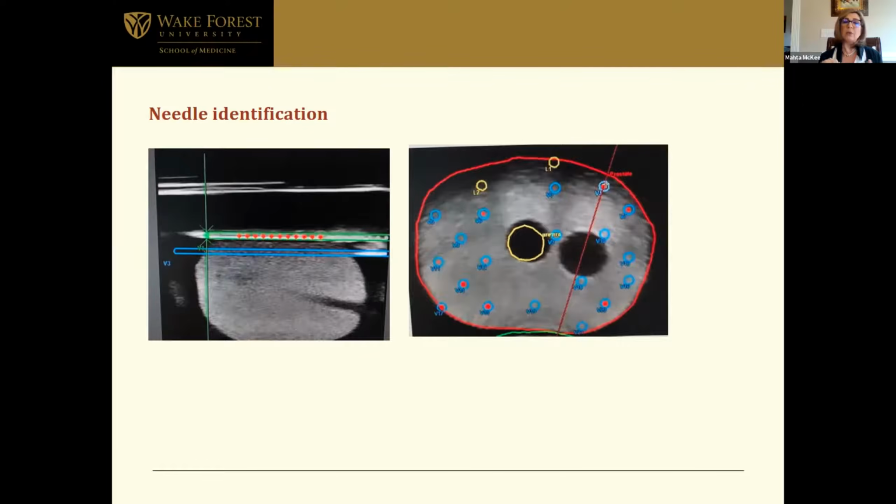And based on that, you're able to say where your virtual needles are. As you can see, I have a V in front of those numbers, and the two yellow that you're seeing is the live needles. As soon as you select your virtual needles after you've allocated where locations are, and you insert your actual needle through, you're able to guide your virtual to overlap with the real needle. And at that point, you would know your virtual would transfer into the live needle that you have there.